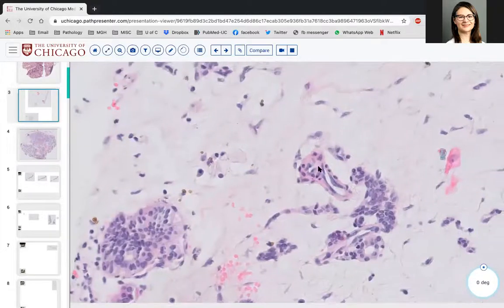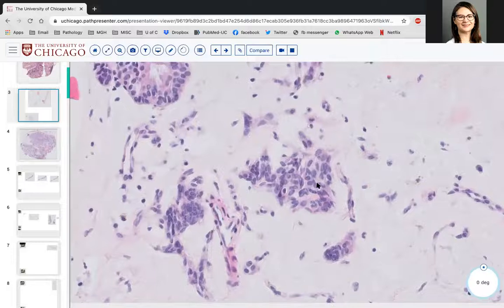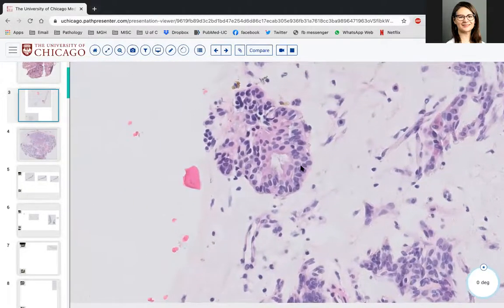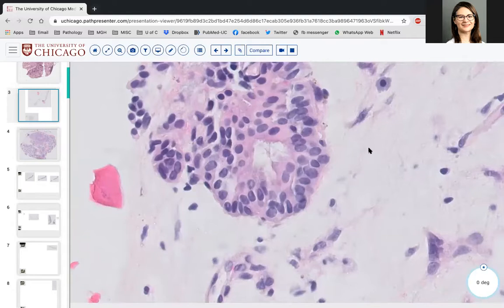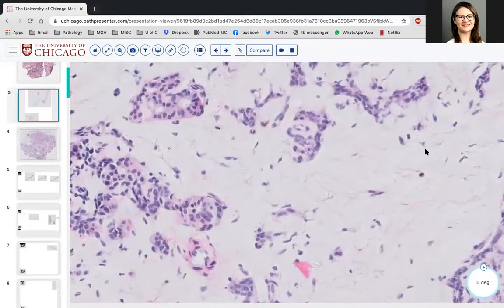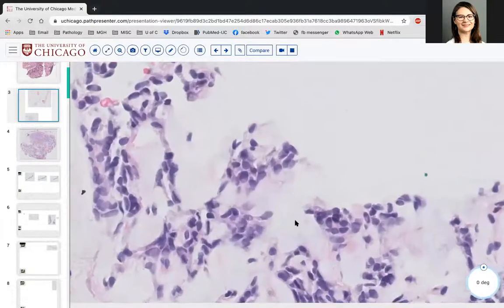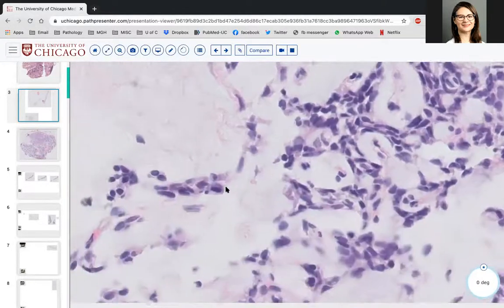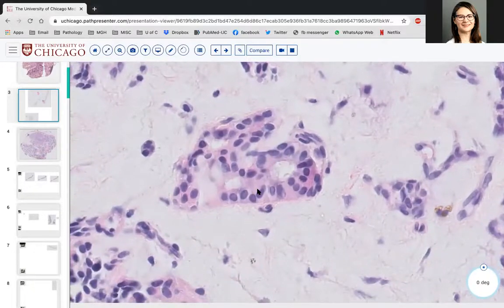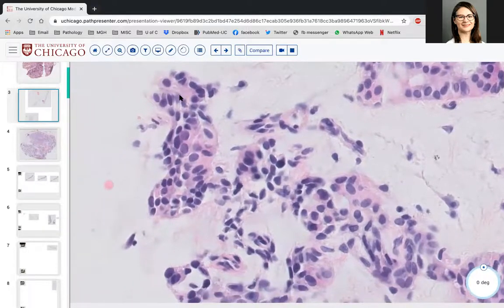Right. So we think this is predominantly connective tissue with stromal mucin, since we don't see any in the cells. We know that this is produced by myoepithelial cells, and we vaguely see a bilayered duct-like structure. So as you said, we're favoring the myoepithelial rich, stromal rich compartment of a pleomorphic adenoma, which is a very fine thought process. The important question is, do you see any high-grade features? Lots of mitoses, lots of nuclear atypia, anything that might suggest a high-grade carcinoma? No.